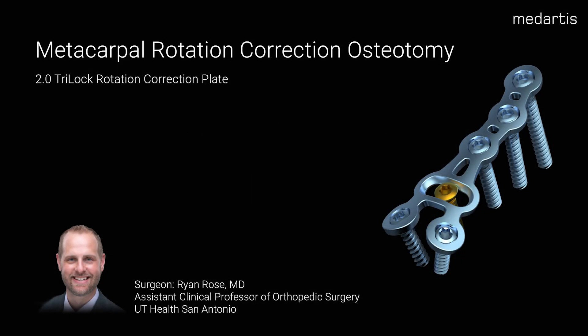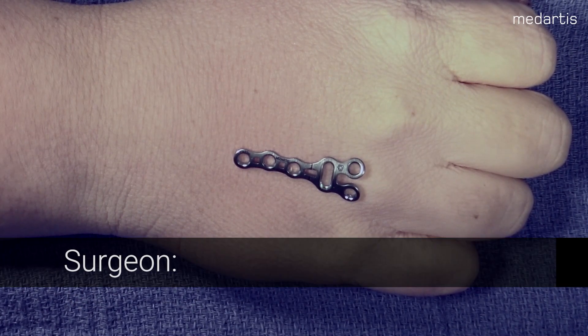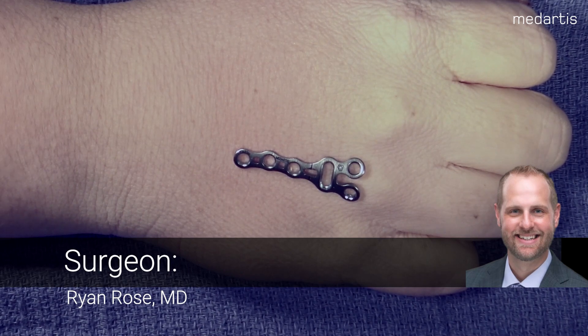Introduction. Tri-Lock 202.3 Rotation Correction Plate. I'm Ryan Rose from UT Health Science Center, San Antonio. Chapter 1: Landmarks and Approach.